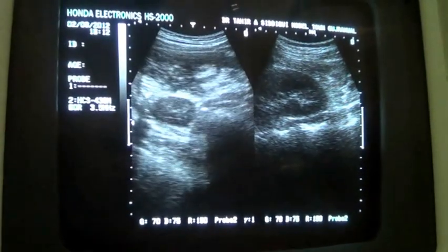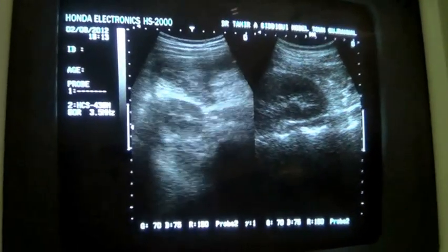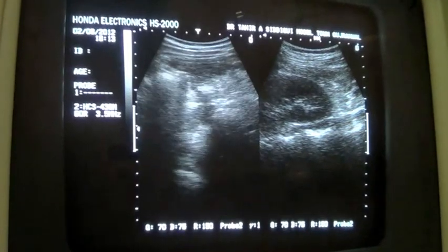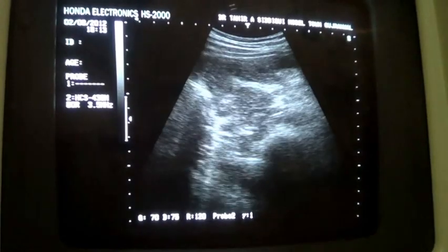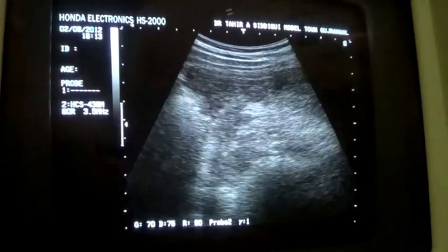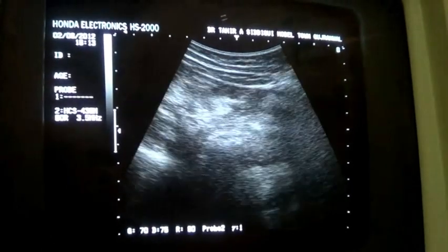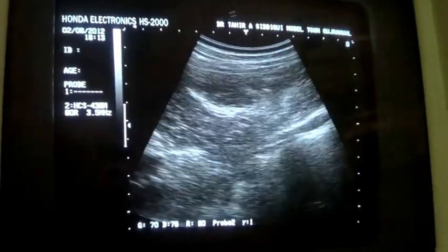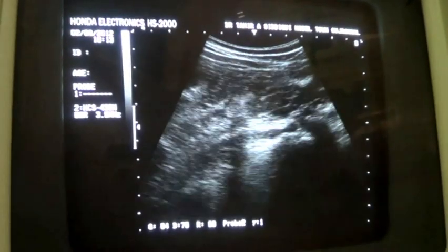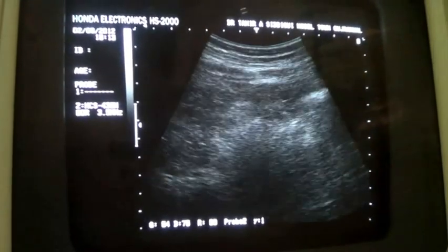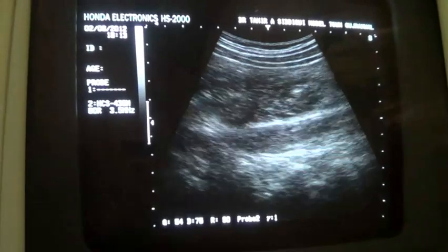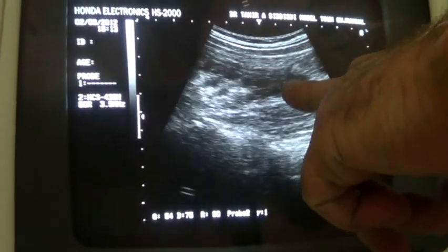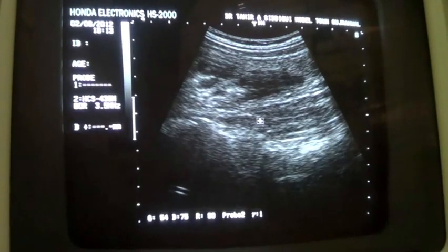Coming down in transverse section from the lower lumbar region and subumbilical region, with patient supine, moving the probe downwards and magnifying slightly. On the left side, this is the psoas major muscle. This is the paracolic gutter, and above it there is a very small amount of fluid in the left paracolic gutter — this black area here.